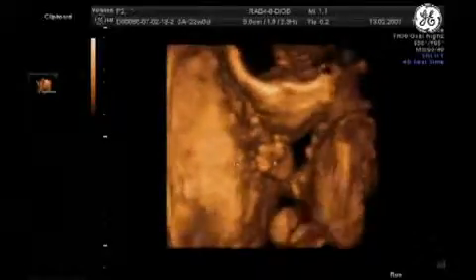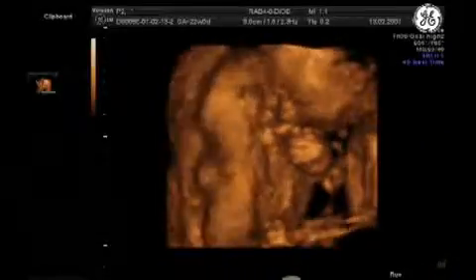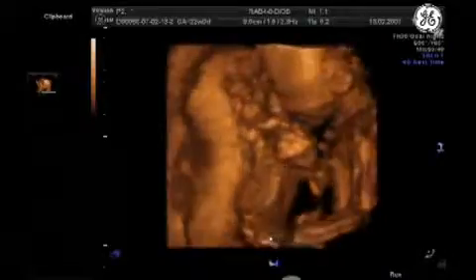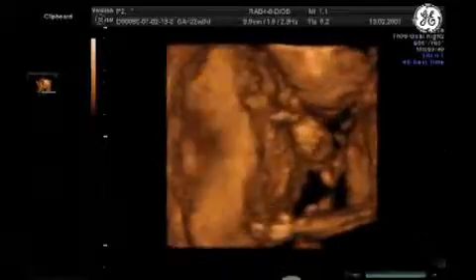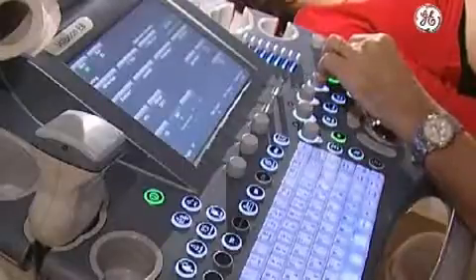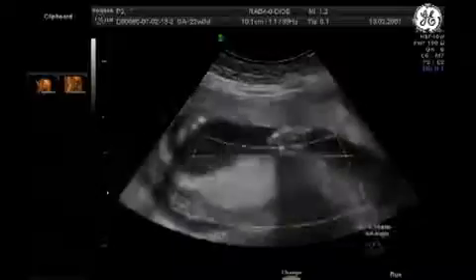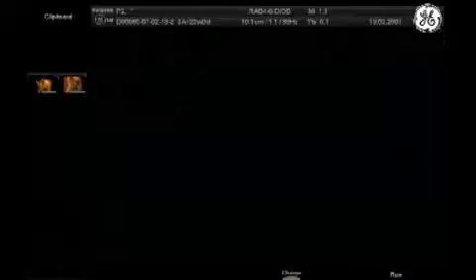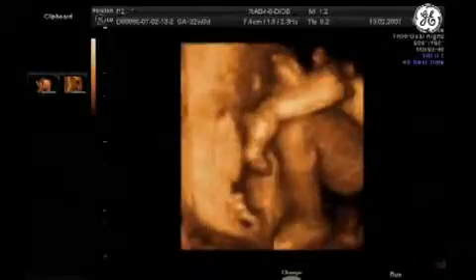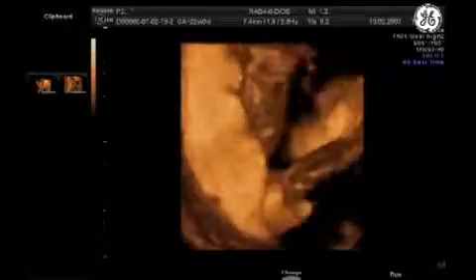This is the hand here. The other hand. I save it. The legs. Is kicking. Okay.